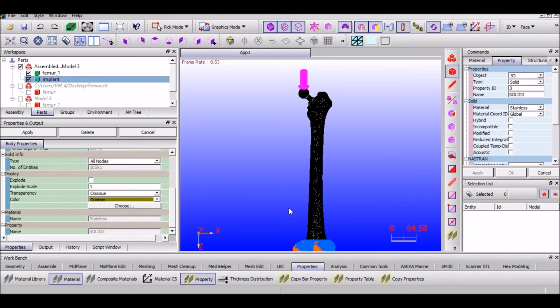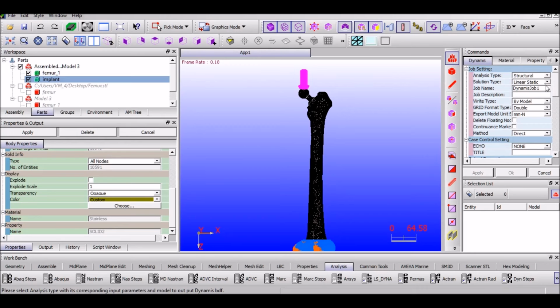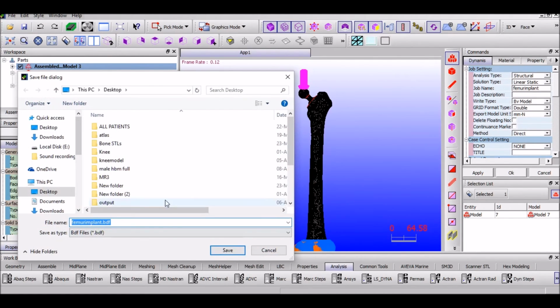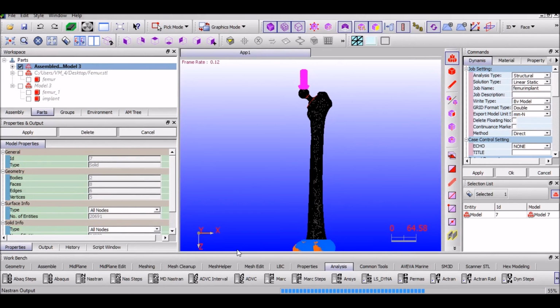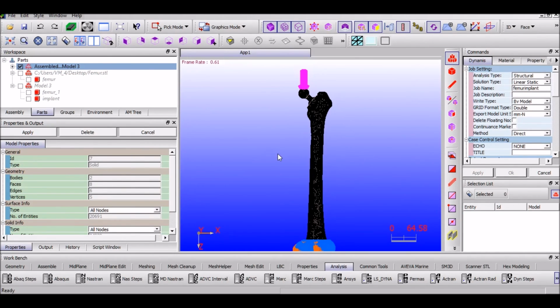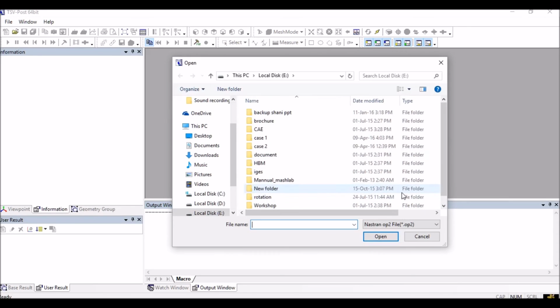Now that the material properties have been assigned, the next step is to generate a file for analysis. For that, go to analysis, select Dynamis, create a new job and click apply. The file will be generated. After running the file through Dynamis, a .op2 file was created. Now this .op2 file needs to be imported in TSV Post software.